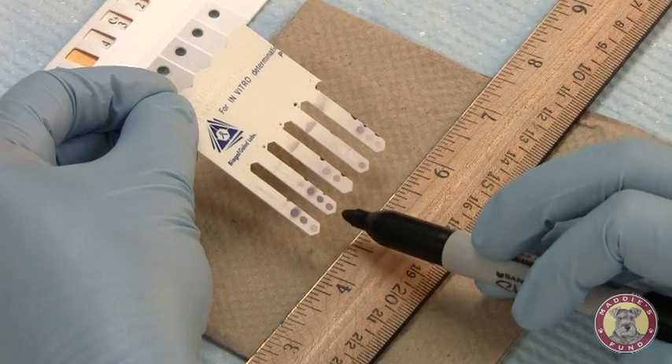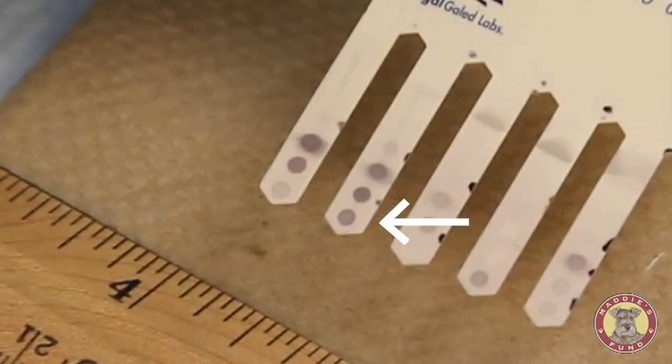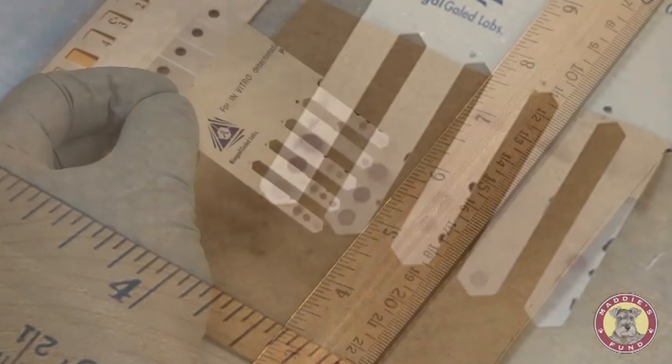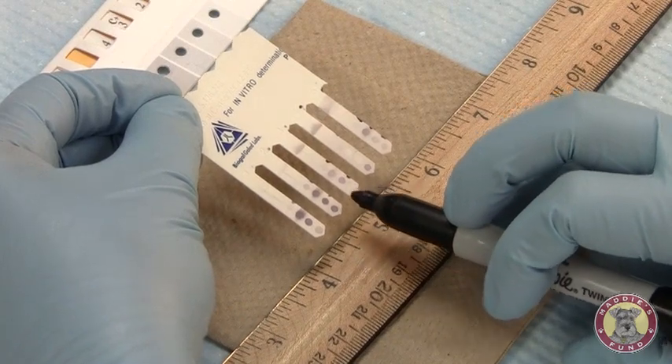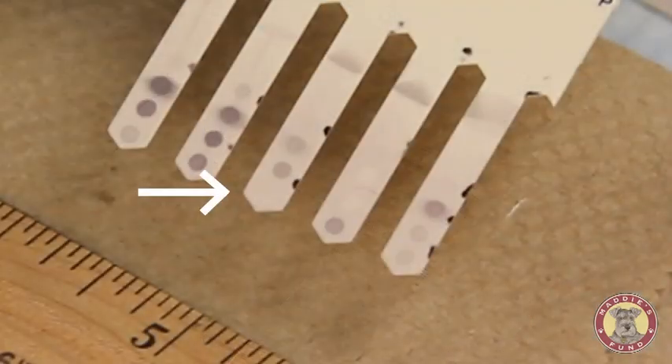Sample 2 has a dark color development. Comparing it to the positive reference, it's darker than that development. We'll call this a 5. Sample 3 — you can see there's no color development. Comparing it to our positive control, the sample is blank, so it will be 0 or a negative.